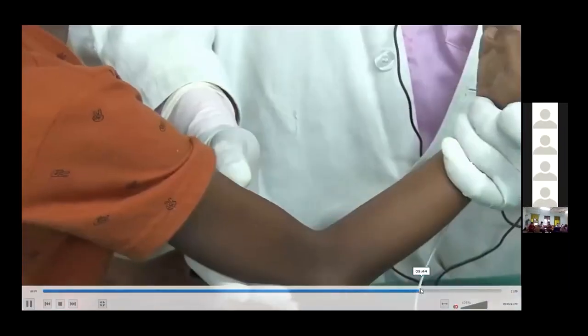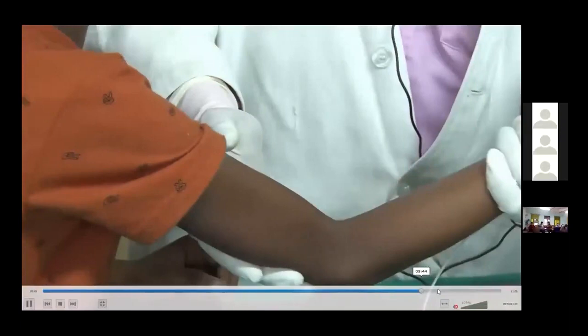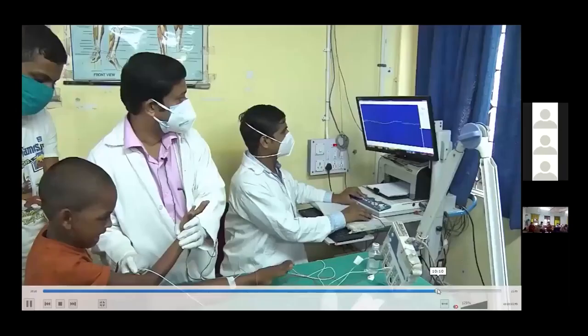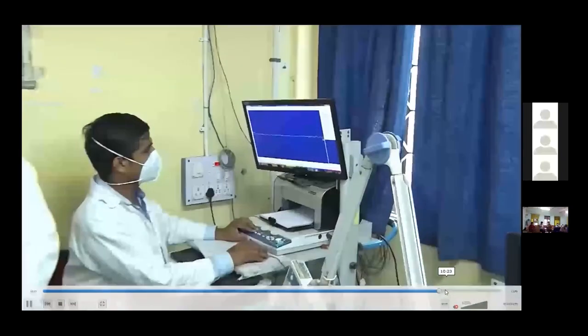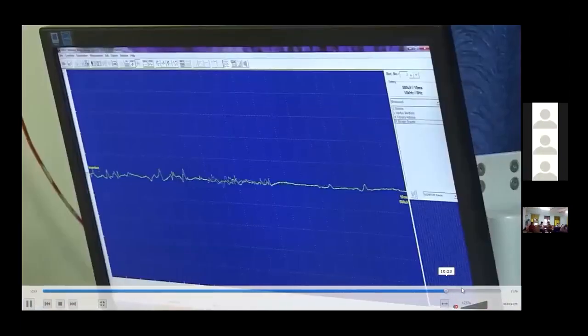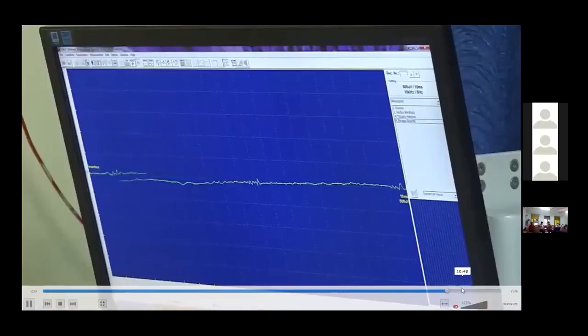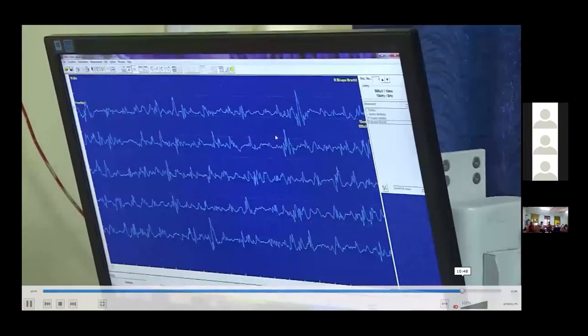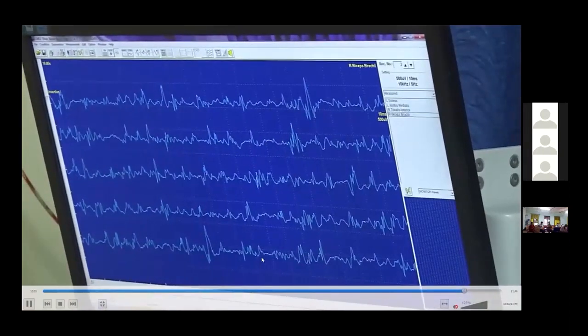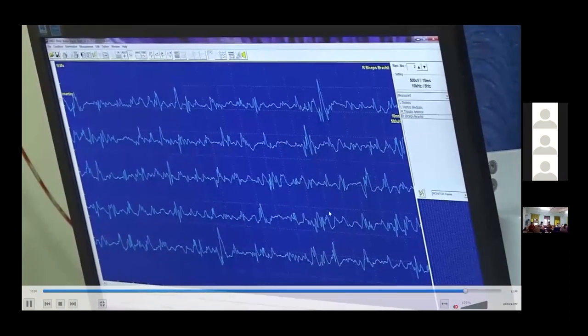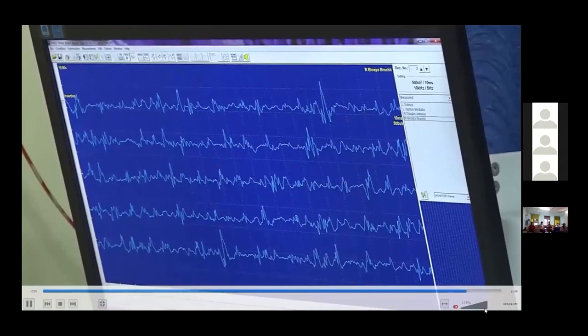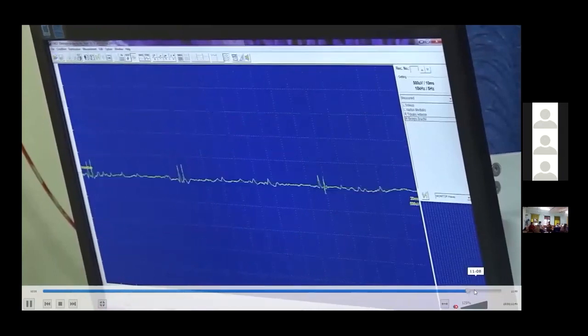Now after the lower limbs, we started with upper limbs. And found the similar findings. And we always see this thing in cascades so that we can assess the number of phases and the number of MUAPs as well as the durations.